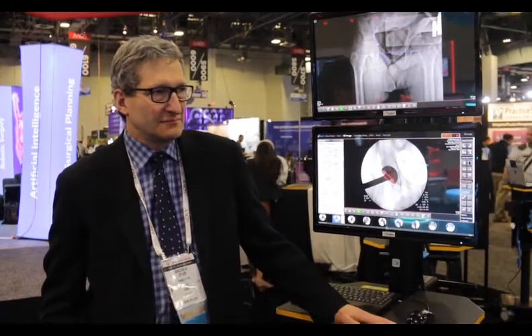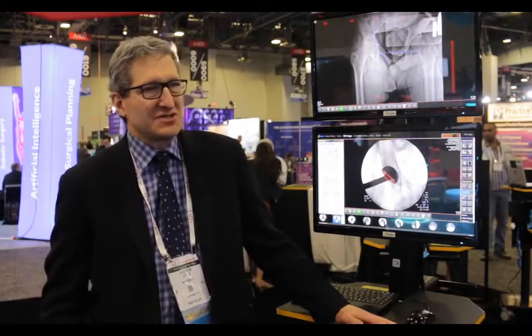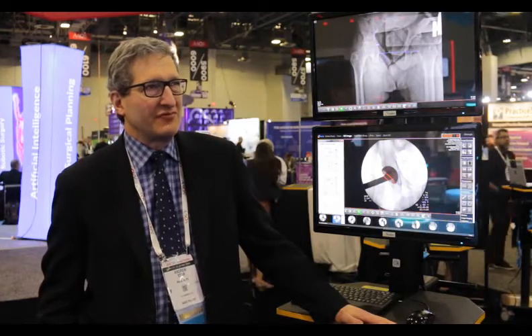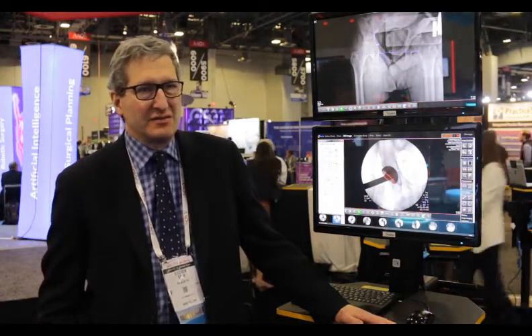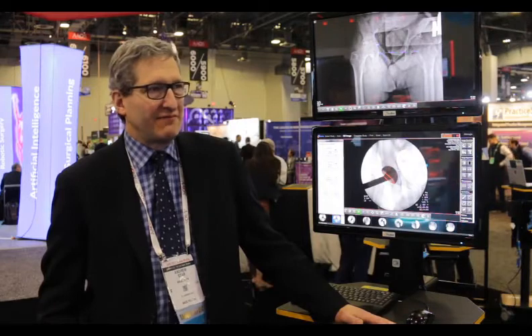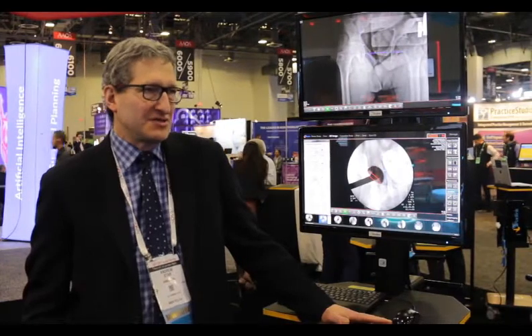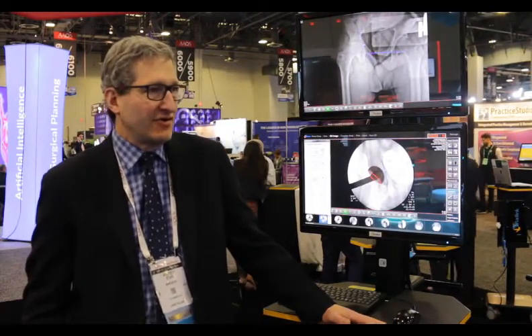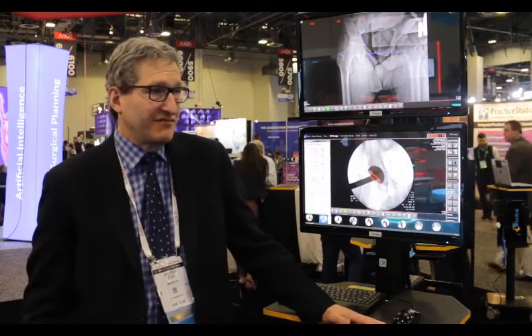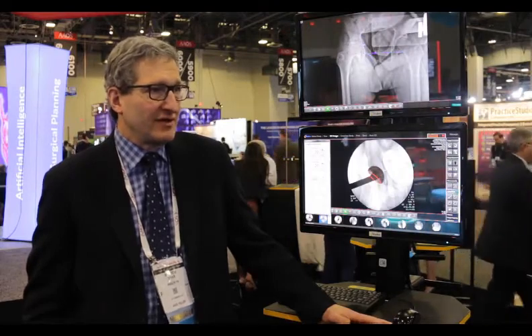When utilizing the software, what measurements are you critically looking at during your cases? Well, I think everybody focuses on cup position as the first thing, because that's the first thing you put in. But we look at cup position, leg length, particularly with some of the more recent information about the importance of cup position and how it relates to spinal deformity and spinal abnormalities. It really gives us the ability to look at pre-op and post-op films and get a really good sense of where we want to drive these implants to. And then, of course, cup position and leg length and offset are very, very valuable in terms of patient satisfaction, function of the hip, dislocations.